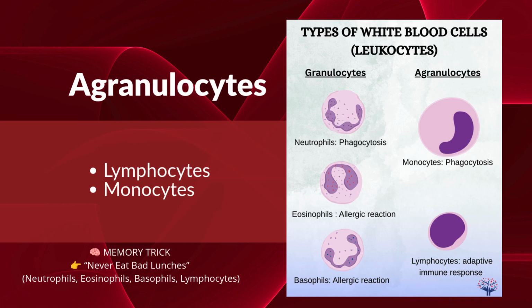Reactive versus malignant is very important for MLS. Reactive lymphocytes and lymphoblasts: I'm going to talk a little bit about lymphoblasts first. In a high yield comparison, reactive lymphs have mature chromatin, an irregular shape, while blasts have fine chromatin, a uniform, immature appearance. Think of a viral infection or leukemia.